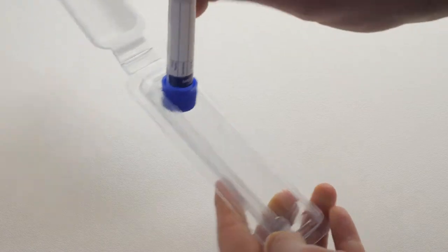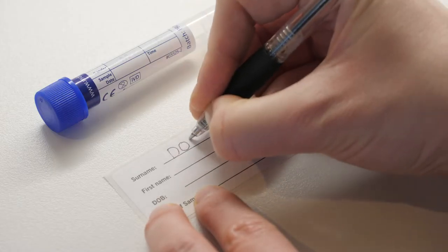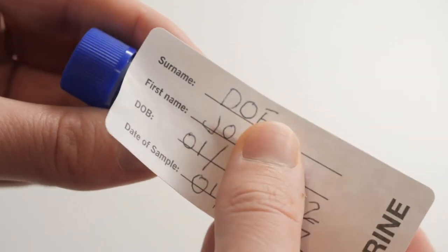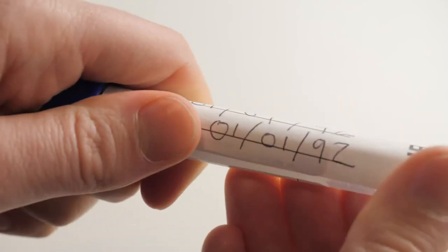Unpack the testing kit. Write your full name and date of birth on the label named urine supplied in your pack. Affix the label by placing the tube in the middle of the label and wrapping the label around the tube.